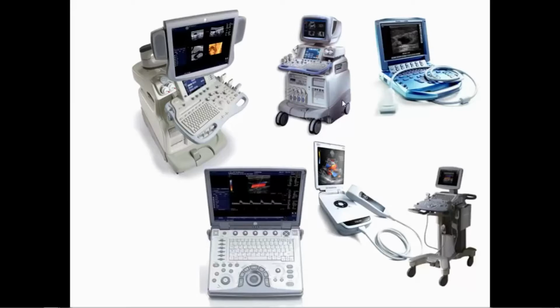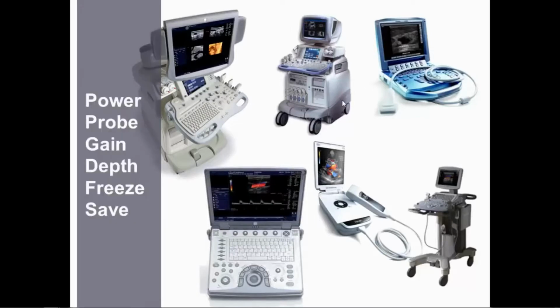So we need to standardize our interpretation of this a little bit because the manufacturers aren't going to standardize buttons anytime soon. So when you go to your own institution and you look at your ultrasound machine, these are the buttons that you need to figure out. Have somebody show you or read the manual. Where's the power button? Which button lets me select a probe? How do I control the gain, the depth? And how do I freeze and save images? How do I store these images for later use? Maybe you'll want to know how to press the print button because you have a printer attached. The idea is how do you save the images?